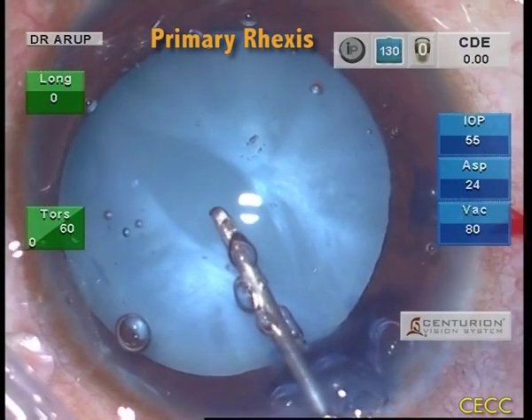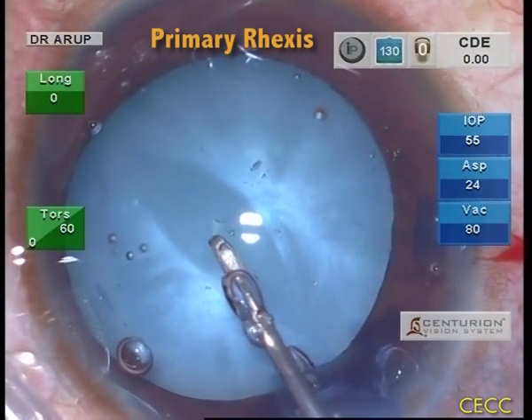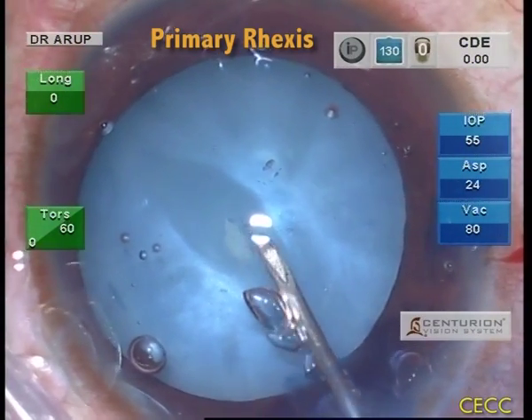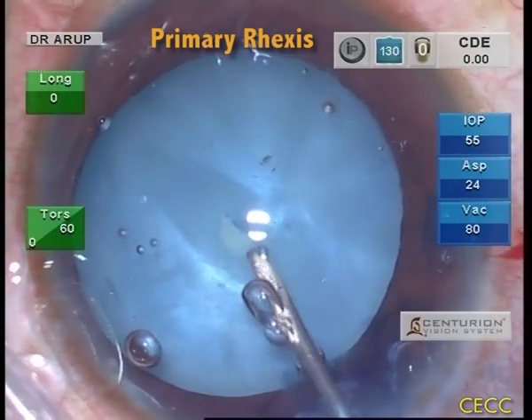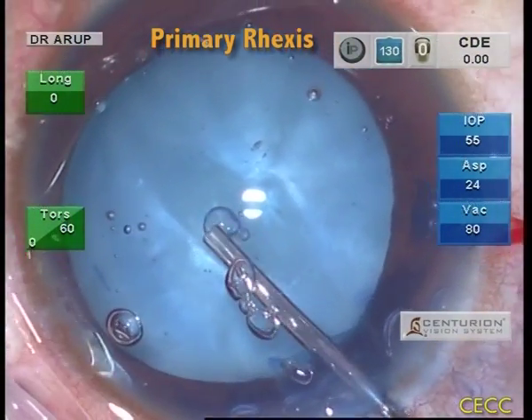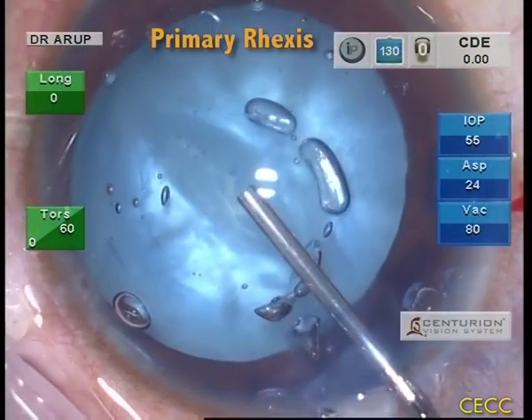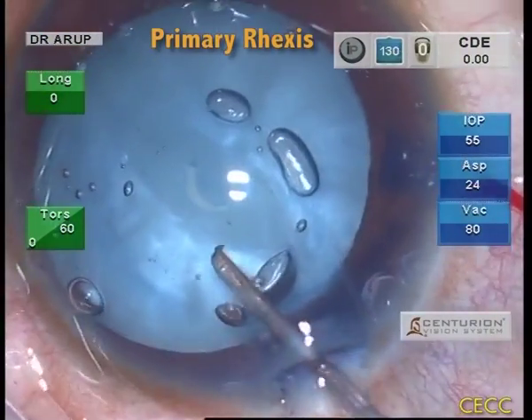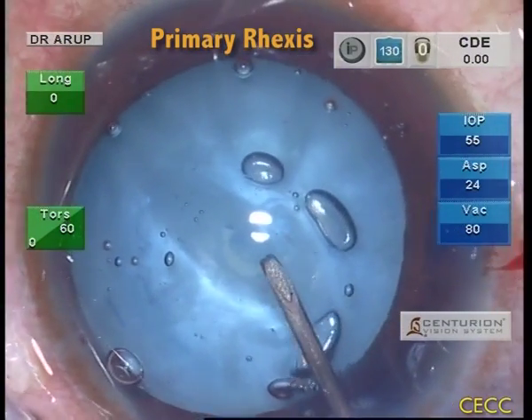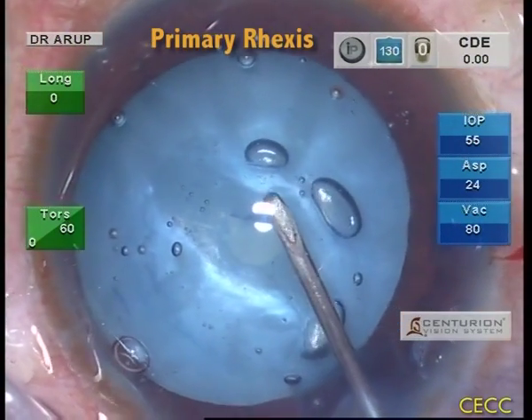A 26-gauge cystotome is used to puncture the central anterior capsule and raise a flap, which is gently turned around as we plan for a preliminary small RHEXIS. Healon V is repeatedly injected peripheral and central to the developing capsular flap to provide a deep anterior chamber. Since the cystotome doesn't offer much control over the flap, we decided to continue the rest of the RHEXIS with micro-RHEXIS forceps.